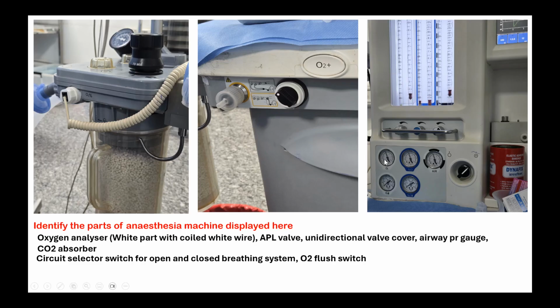And what are all these things? Pressure gauges, for both the pipeline as well as the cylinders. Okay, this is called the pressure gauge panel. What is this? Master switch. Very good. And again, this is the metal guard which you have seen already in the other picture.